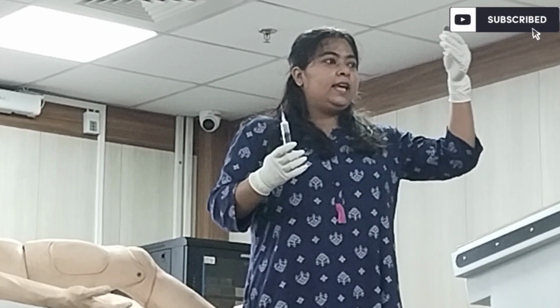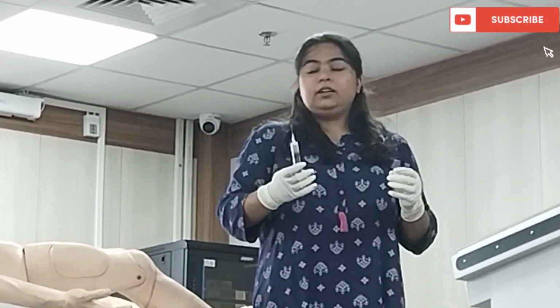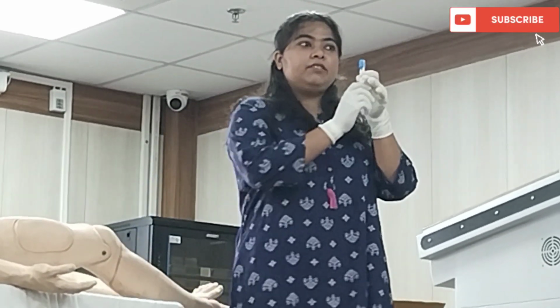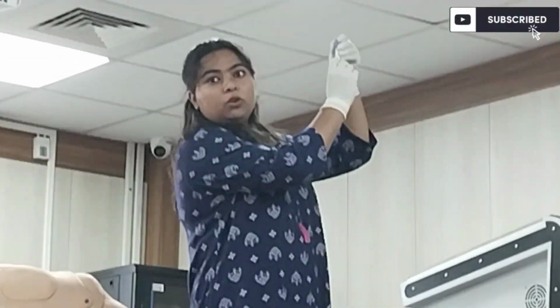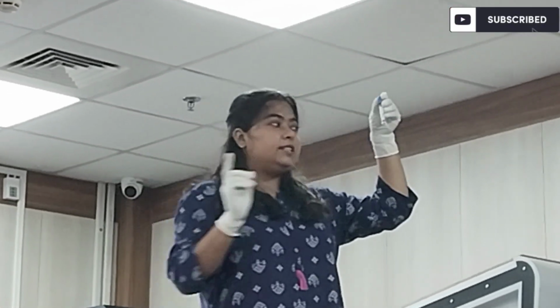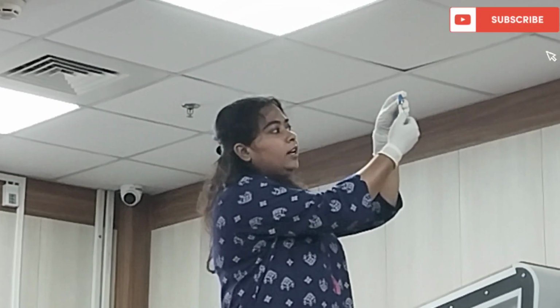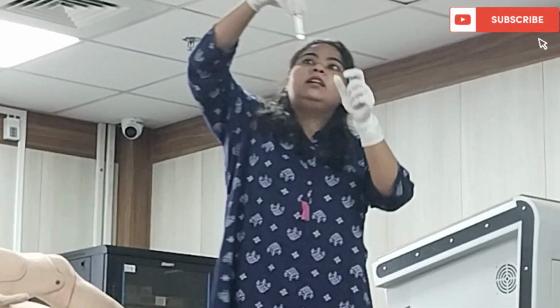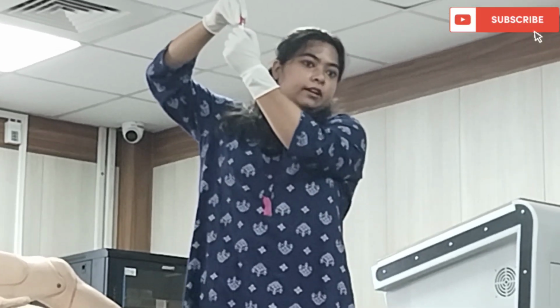But here, that provision is not there. There is a marking over here of some reagent inside. So this is citrate, that is EDTA. There is a marking. Here you see this is a marking over here. On the clot vial, the marking is quite up here.